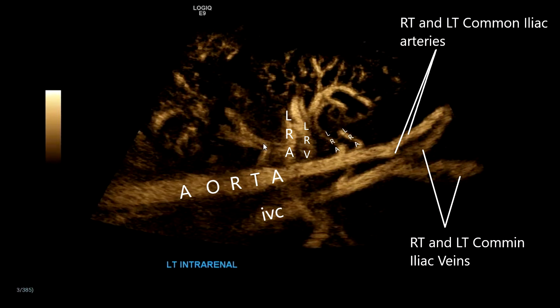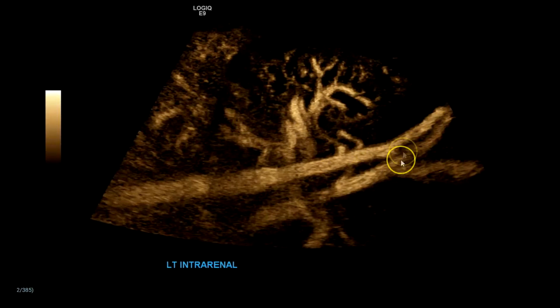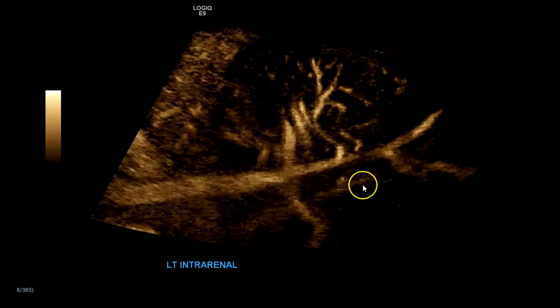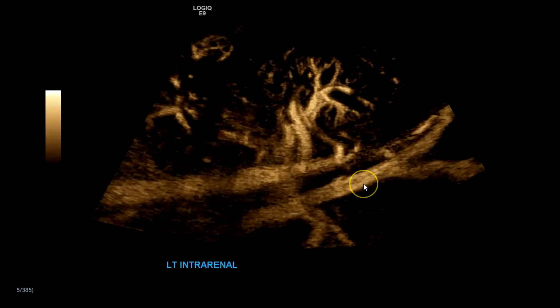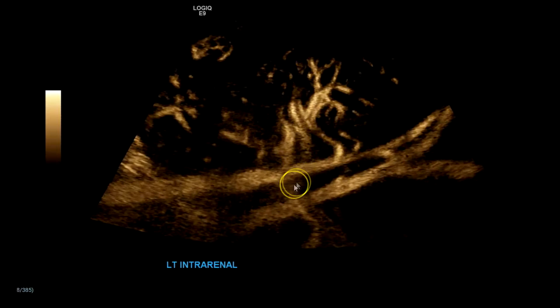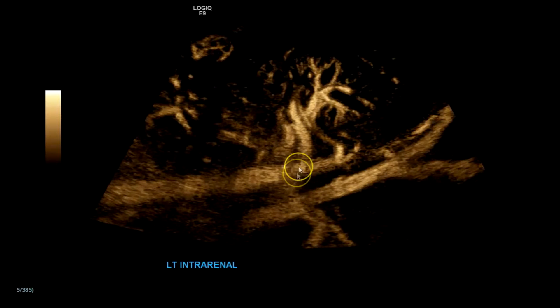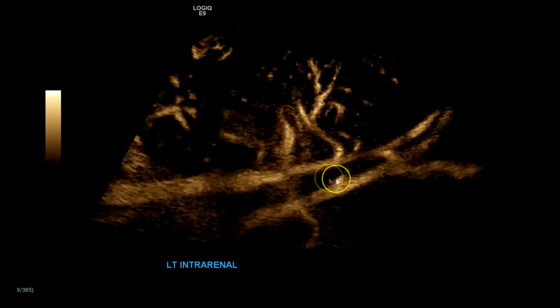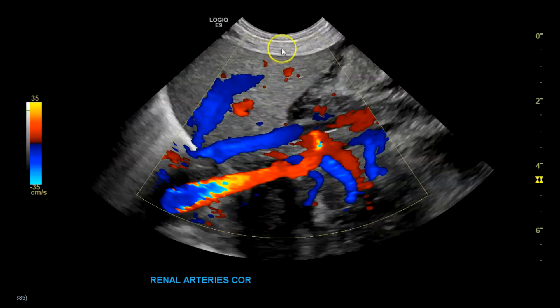You can see the bifurcations and the confluence of the aorta and IVC very clearly. Remember that the left renal vein goes over the aorta and posterior to the superior mesenteric artery. Slight coronal view from the right — you see the liver here, hepatic vein, IVC, and then you have your aorta.